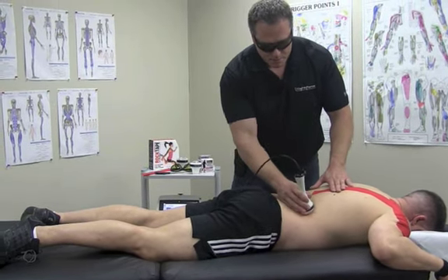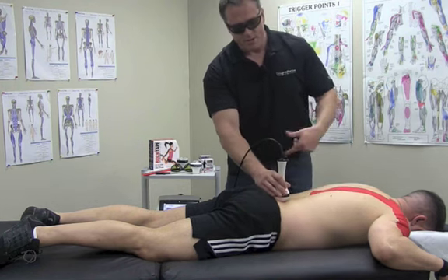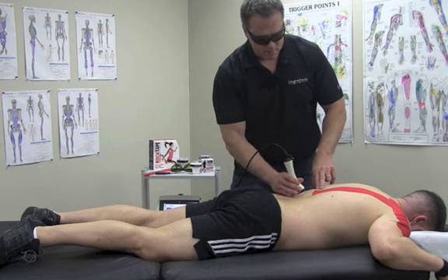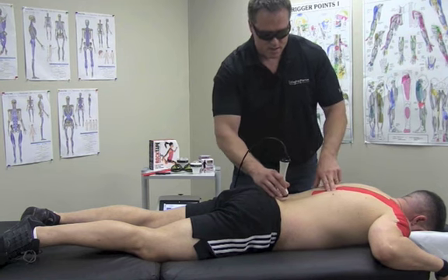So this can be done prior to an event, a single event or a competition, and it's great to do it post as well, to do a pre and post laser treatment. Can make a big difference on post-workout delayed onset muscle soreness.